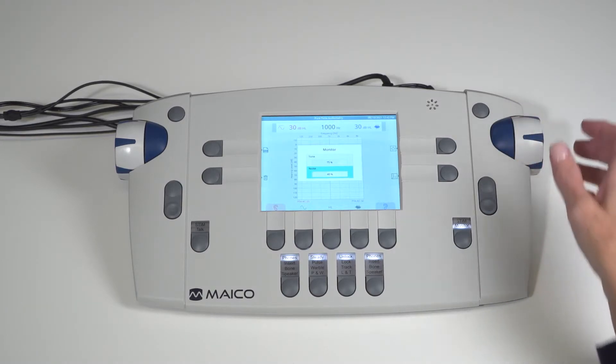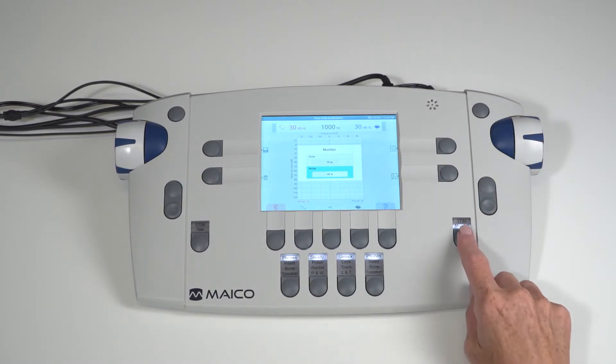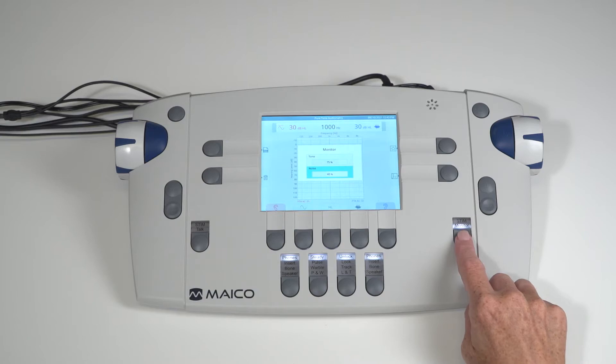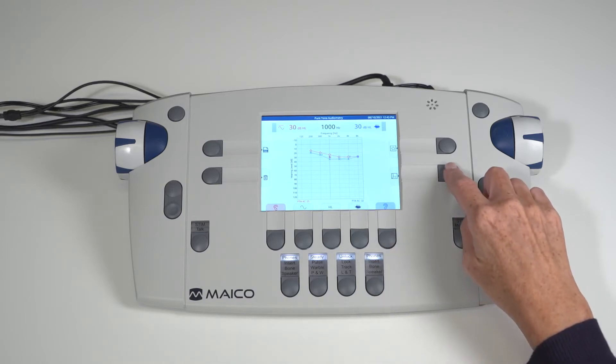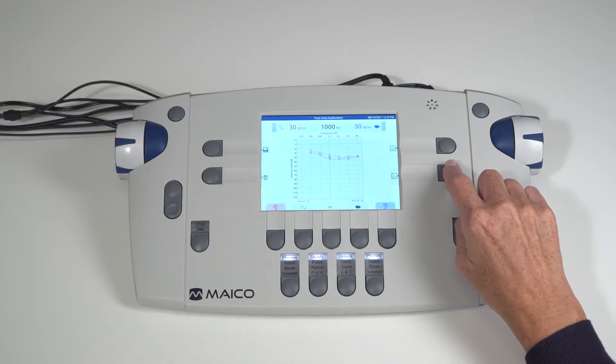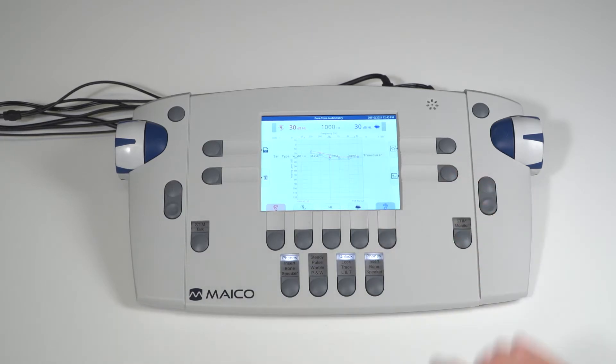When monitor adjustments are completed, single press the stim monitor key. The monitor function works independently for the tone and speech test. To set monitor level for speech, go into the speech screen and perform the same actions.